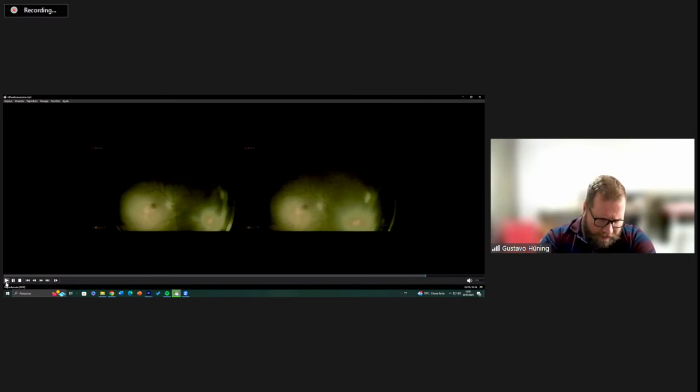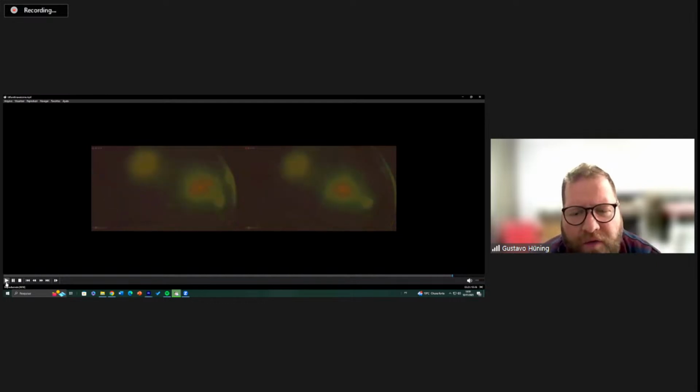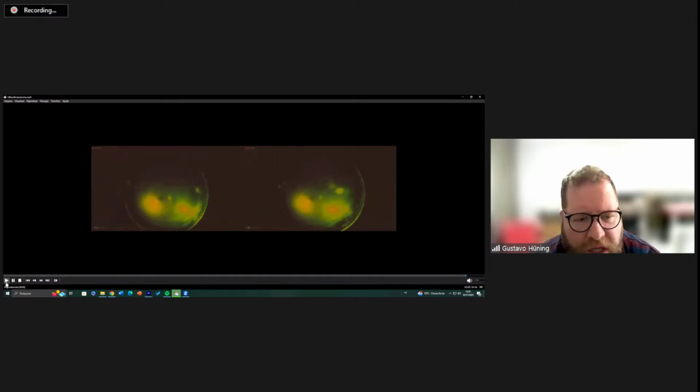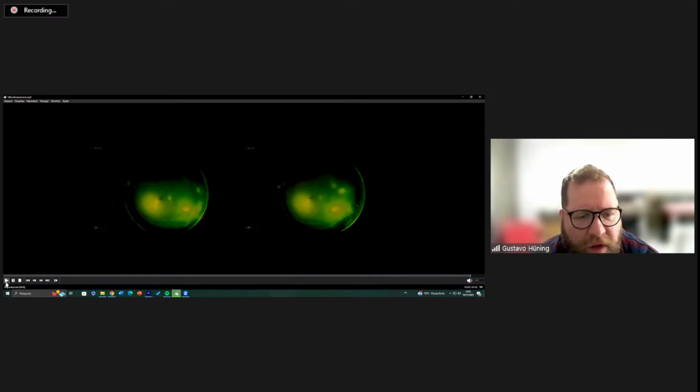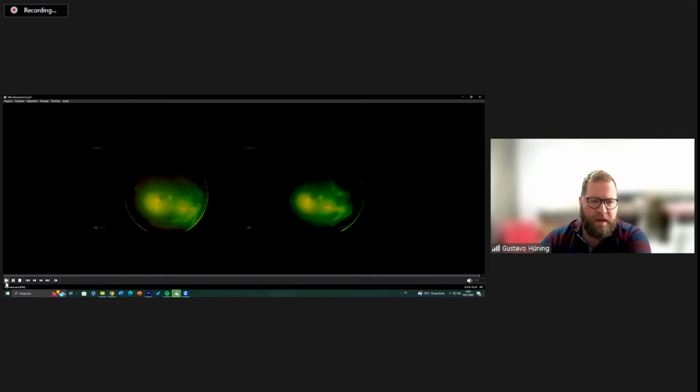So the thing here is you have to take your time. You have to take one case to try to find a way, like here, the edema in orange, okay, better than in the other cases. And coming back, you have to take your time to try to find what works for you. Talk to colleagues, exchange ideas, exchange parameters. I have done this, I have done that, and try to find what suits you better.